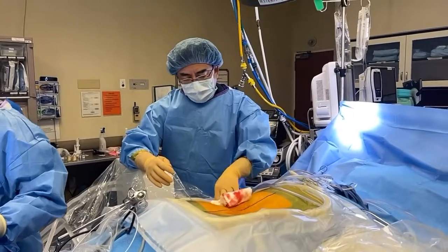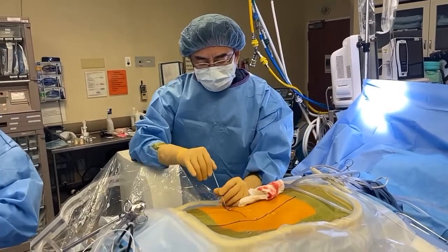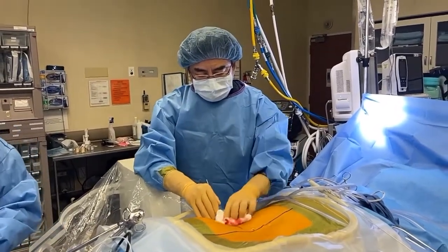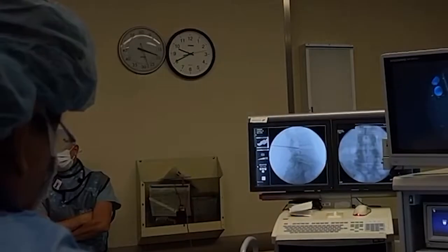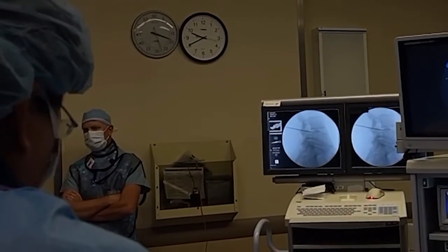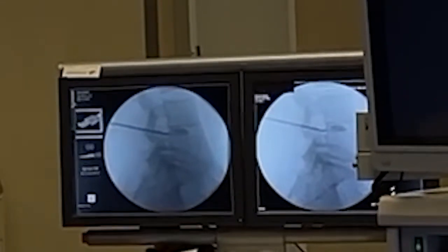Okay, I identify the perfect starting point, and now I'm going to use a spaghetti needle dilator to delicately and gently get to the surgical target site, utilizing intraoperative imaging and delicate Asian fingers. Okay, I've got the skinny needle in. I'm injecting the, it's already leaking out, how pathetic. Shot and save. Oh, look at that. Look at the tear, it goes up like this and then back down.